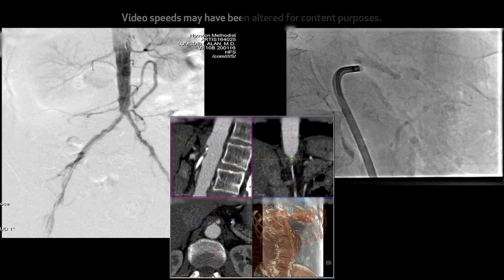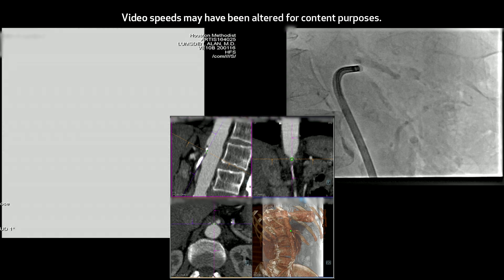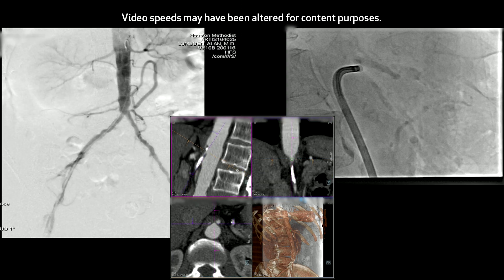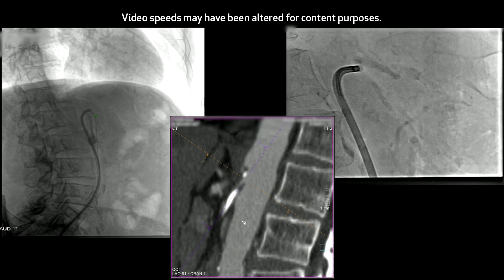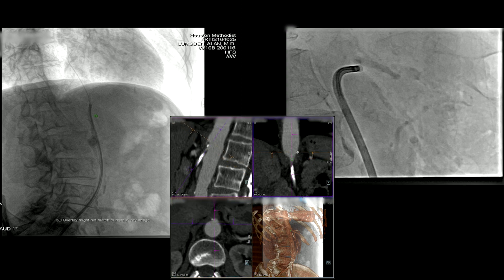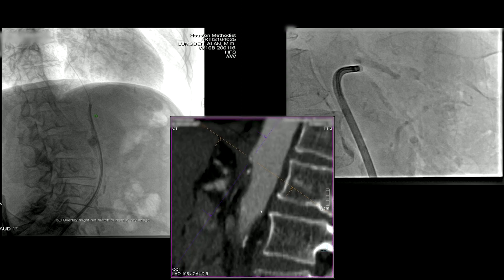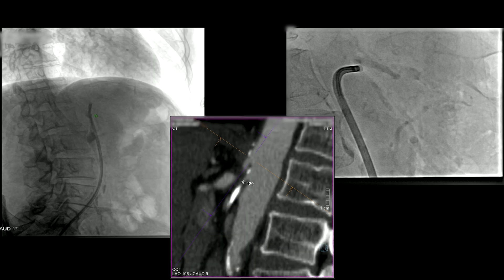Now you can see the calcification in the CT scan. Looking at it, we did think preoperatively there was a tiny channel — that tiny little channel you can see going down there. We never really could elucidate this via angiography. There was a good IMA, and the IMA via the meandering mesenteric artery would fill the superior mesenteric artery. What we're doing now in the CT scan is spending the time trying to mark in what that tiny little orifice is.